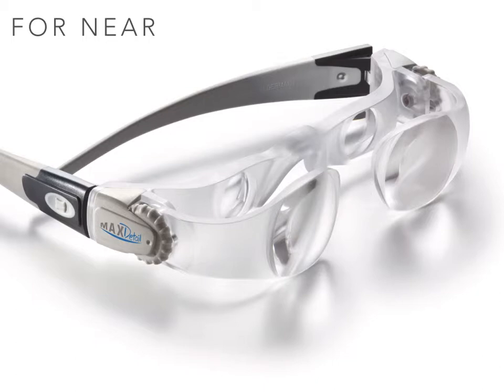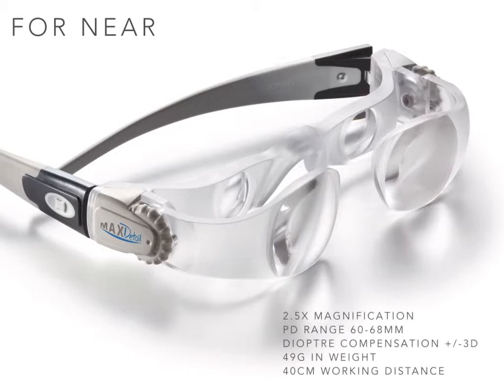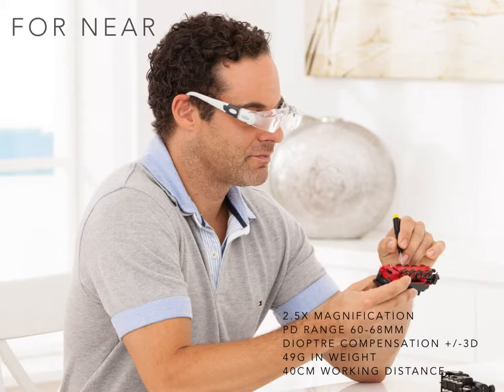Focus can be achieved for each eye individually by using the cog on each side of the spectacle frame. This device can compensate for a wide range of individual spectacle prescriptions. Its lightweight design fits most faces, with the additional benefit of fully adjustable reinforced sides that may be altered without the need of a frame heater. By far the greatest advantage of a device of this nature is the extended working distance. In this picture, the magnifier is being used for a detailed task held at approximately 40 centimetres, avoiding the need to move close to the desk or hold the object close to the face.